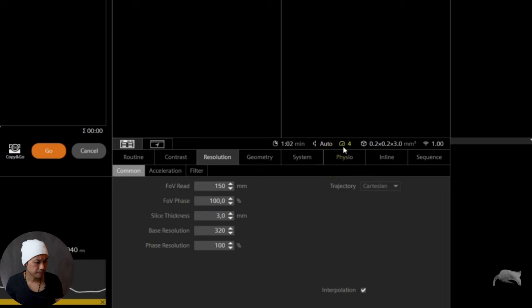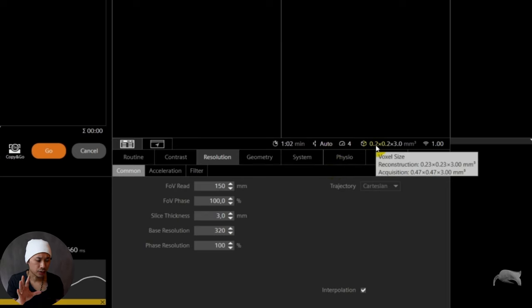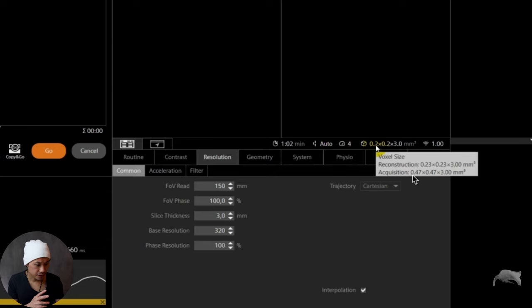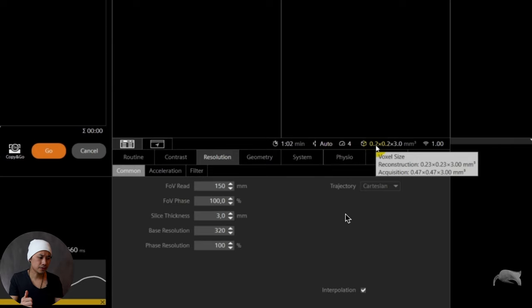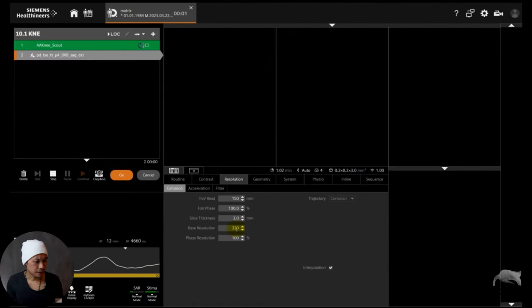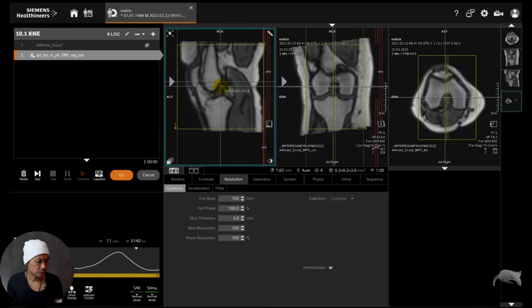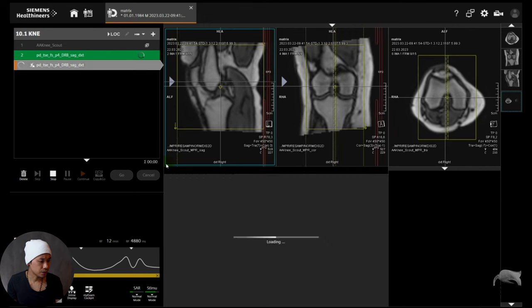We're doing a routine knee here. This is 150 field of view and the base resolution is 320. You can see the acquisition pixels: 150 divided by 320. It's the same for both phase encoding and frequency encoding. For Siemens, phase comes first and frequency later. Then you have a slice thickness of 3mm. Field of view divided by the base resolution gives you the pixel size. Now let's do a scan.